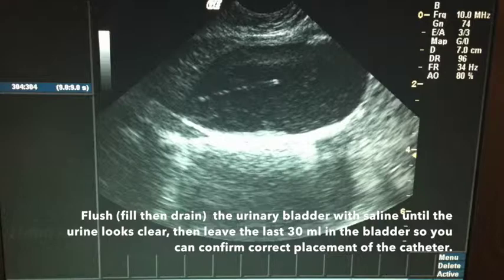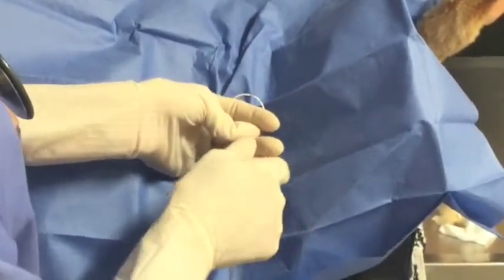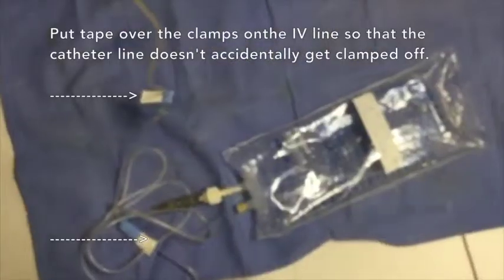Confirm the placement of the urinary catheter using ultrasound, and then connect the catheter to a sterile collection set and urine collection bag.